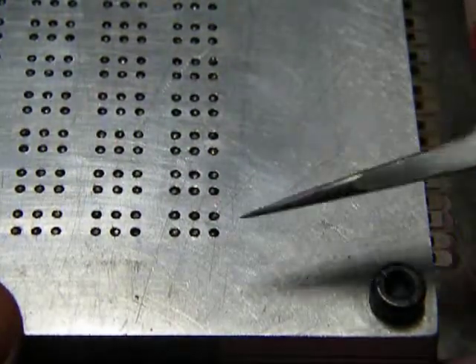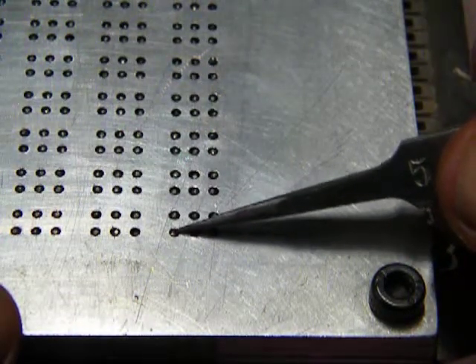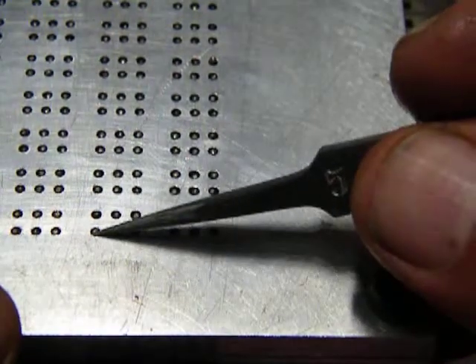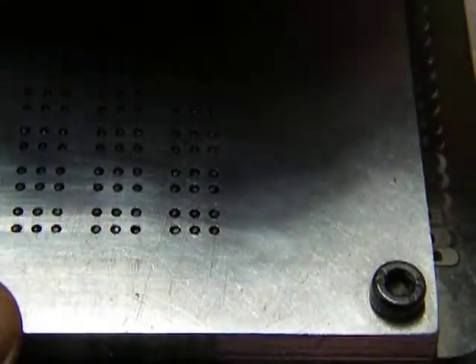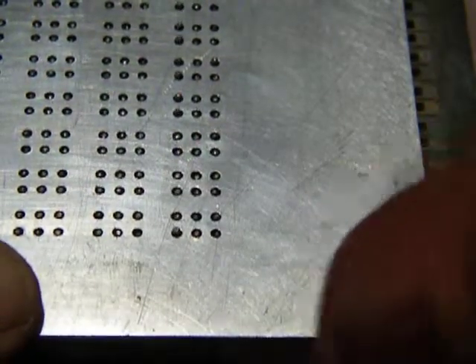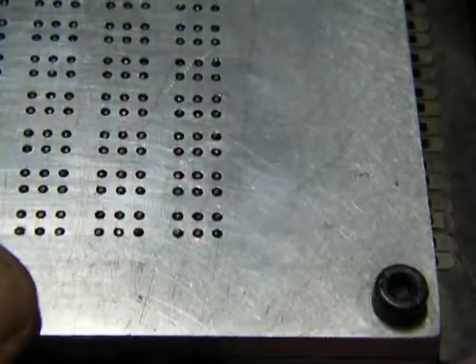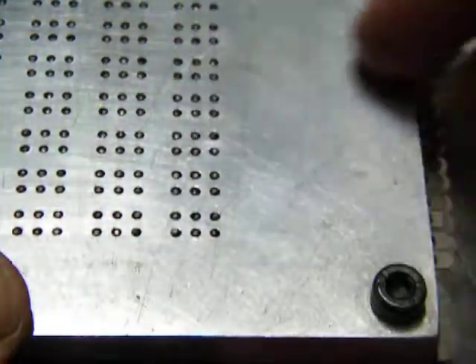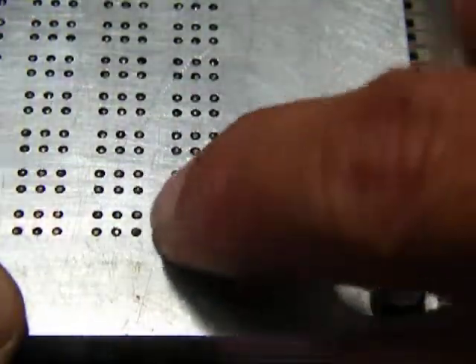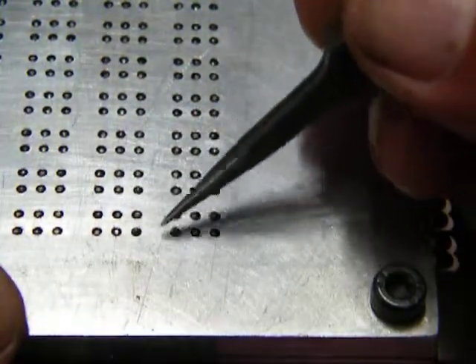So, okay, now suppose we want pin 1 to be actuated in this fifth cell and maybe the line above it. We enable that column. We set pin 1. And maybe, okay, the bottom pin over here, we want to set that one also. Set it. We latch them shut, and then when we release the row actuators, they retain their position. So you've got pin 1 over here, and I think the bottom pin over there. These two pins are the only two that are latched shut.